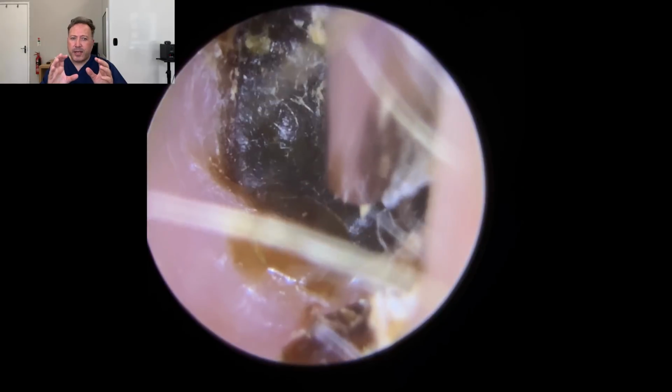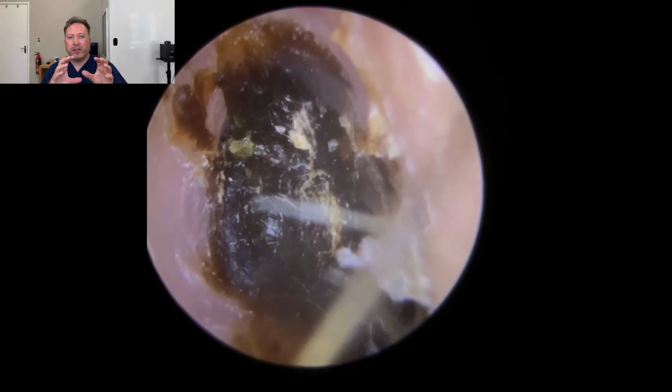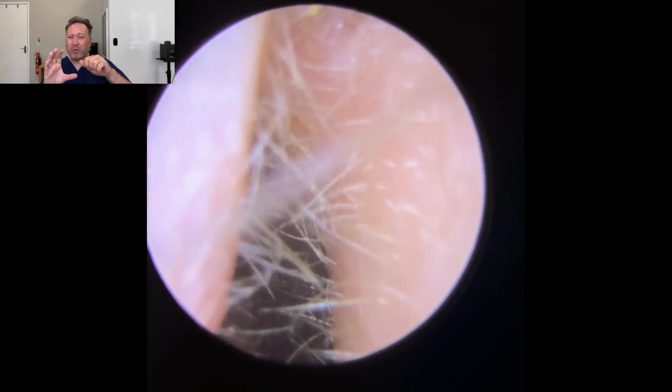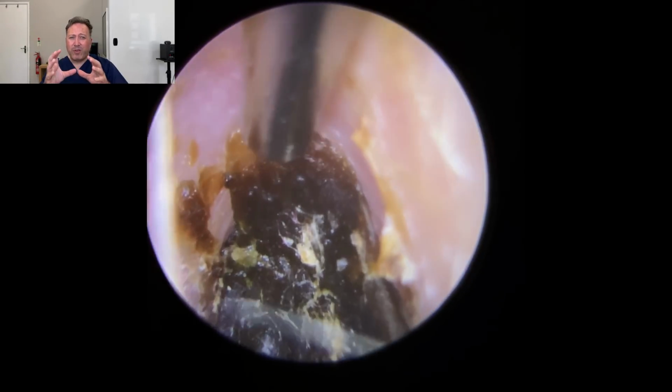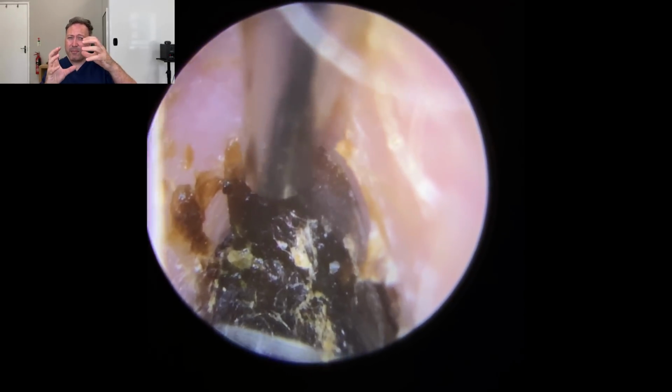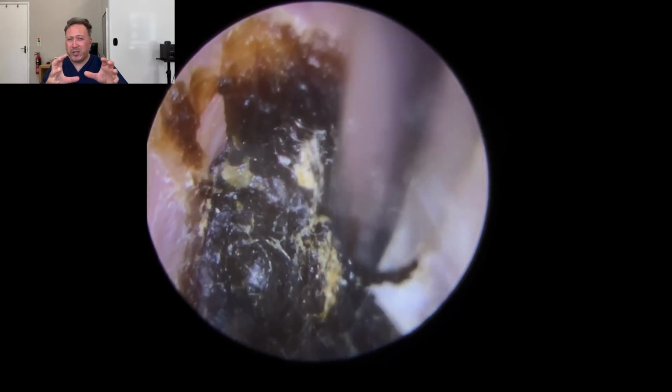But as you can see, it's really, really difficult to find a loose edge around the outside edge of this wax. This patient's done such a good job of pressing this against the canal and allowing it to dry there that we've had this really hardened up plate. This is one continuous piece of wax you can see here that's just really firmly wedged into that canal.